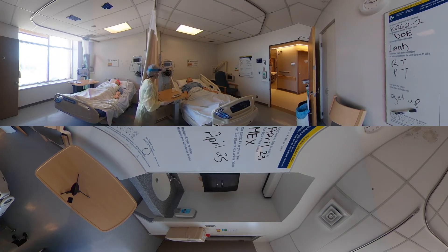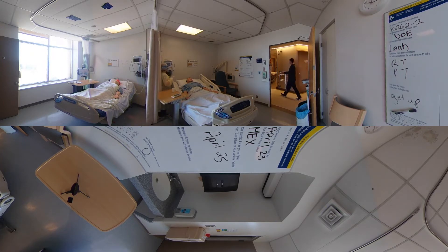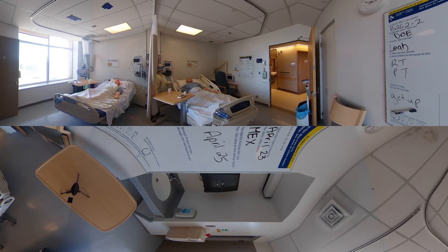Do you mind if I do your vital signs? I'll put the sat probe on your finger there. I'll scan your bracelet. I noticed your sats are 94%. I'm going to try and turn your oxygen from 4 liters down to 3 liters, and we're going to leave the probe on to make sure that you stay above 92%. I'll check back on that.